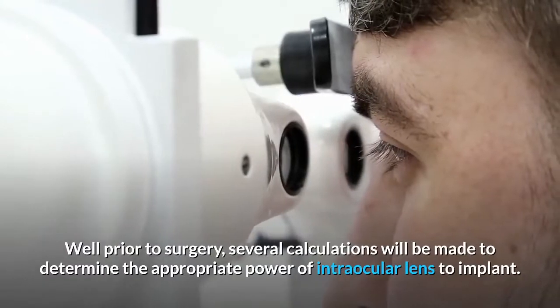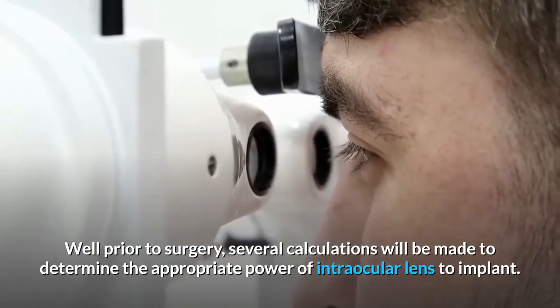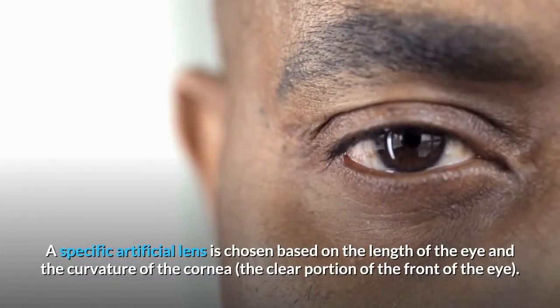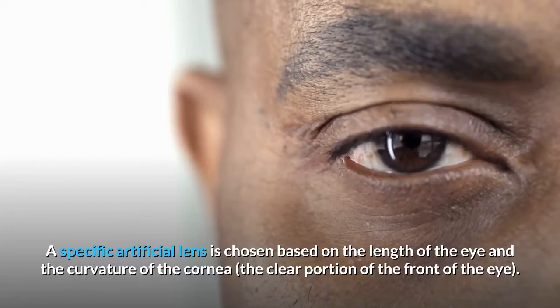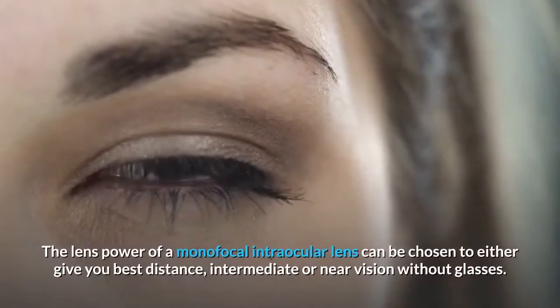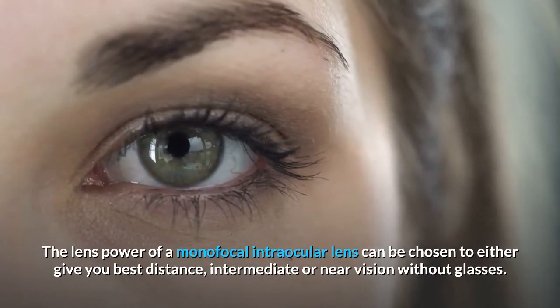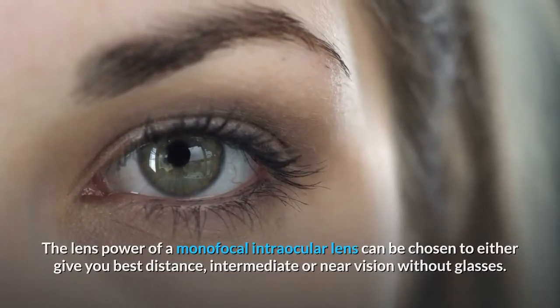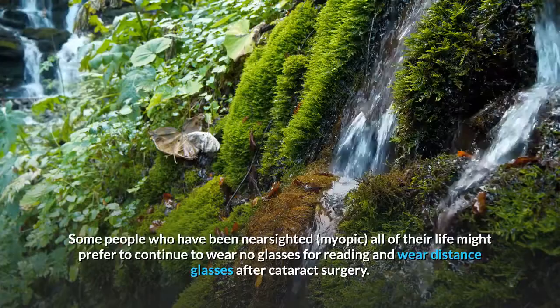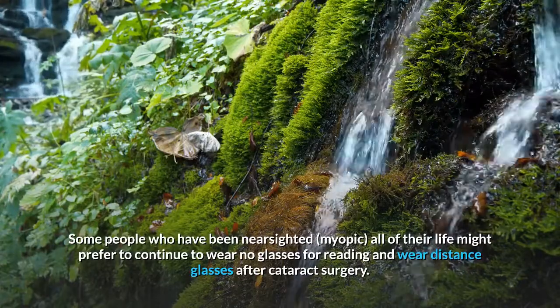Prior to surgery, several calculations will be made to determine the appropriate power of intraocular lens to implant. A specific artificial lens is chosen based on the length of the eye and the curvature of the cornea, the clear portion of the front of the eye. The lens power of a monofocal intraocular lens can be chosen to give you best distance, intermediate, or near vision without glasses. Some people who have been nearsighted, or myopic, all of their life might prefer to continue to wear no glasses for reading and wear distance glasses after cataract surgery.